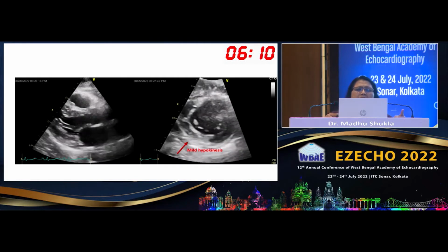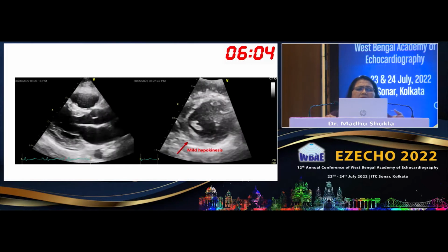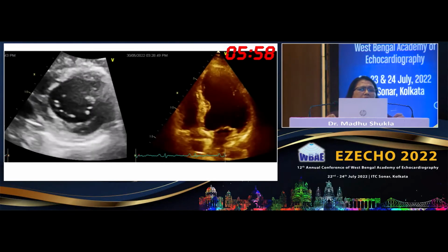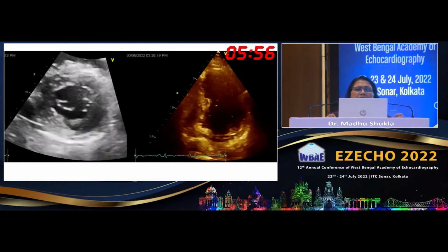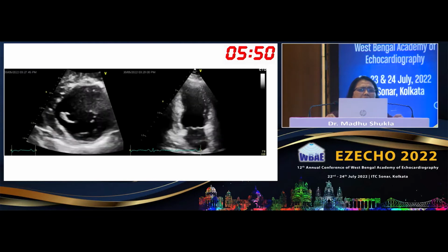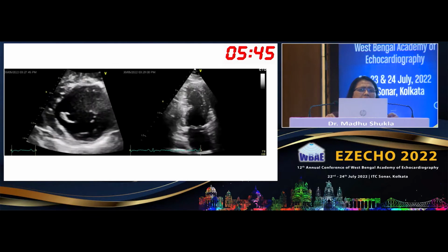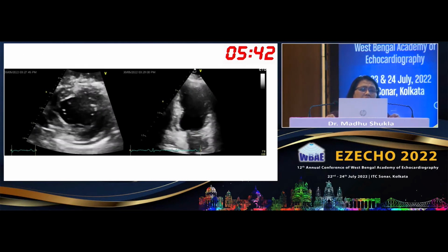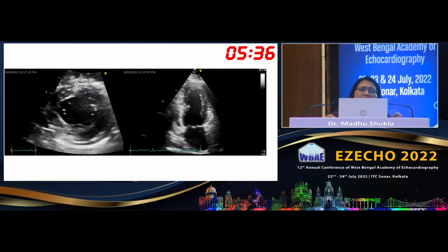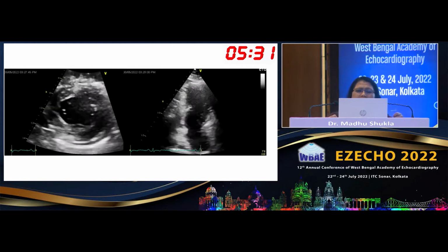In the short axis, in the same region, you can see mild hypokinesis along with increased echogenicity. And this is a further view to show this. And the 4-chamber view is showing normal, basically. And again, you can see mild pericardial effusion and this inferolateral area, which is edematous and hypokinetic. And in the 2-chamber view, you can see the basal inferior wall is mildly hypokinetic with subendocardial hyperechogenicity.